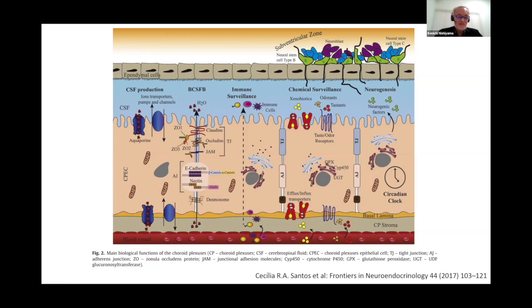The choroid plexus provides some biologically active molecules for neurogenesis in the ventricle and impacts brain homeostasis and also the circadian clock. I think there are not enough studies yet on long-term outcomes or risks about these functions. Thus, I indicate endoscopic lavage with CPC only for severe hydrocephalus with poor prognosis or refractory shunt infection cases.